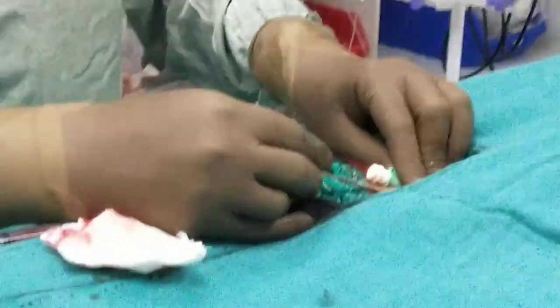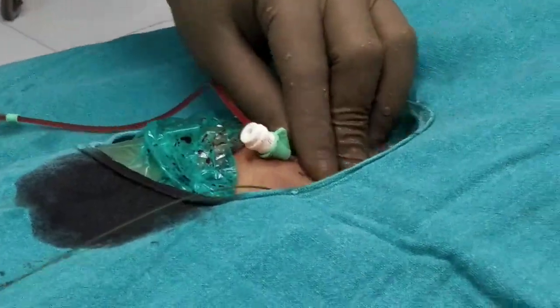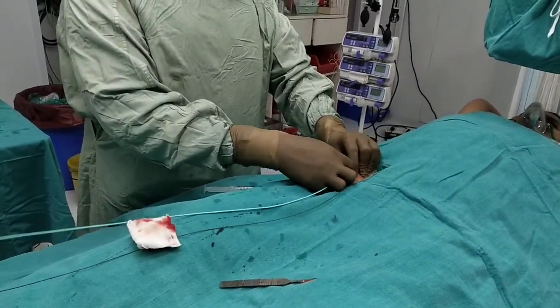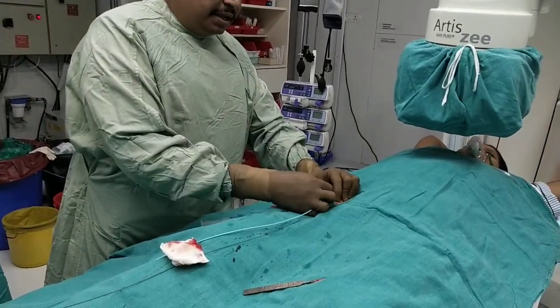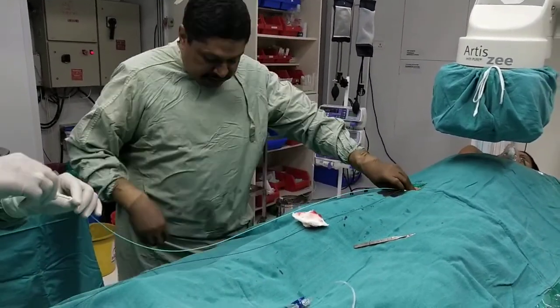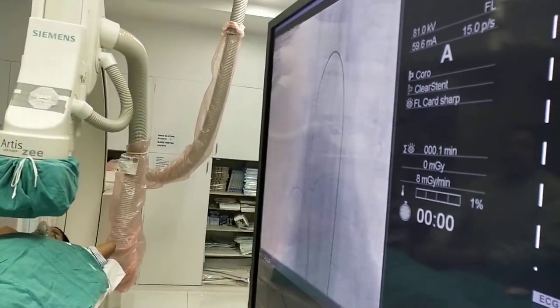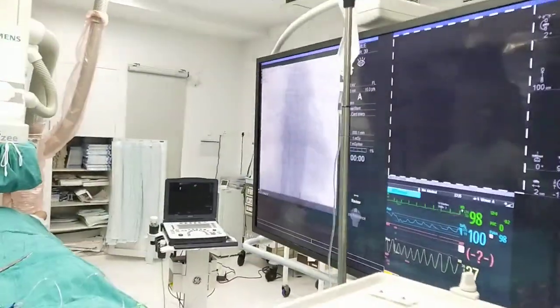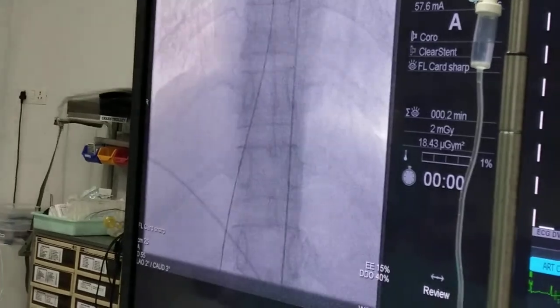We make a liberal cut into the vein because we have to pass a balloon track, so we need a good access area. We will now put a pigtail into the artery up to the aorta, which will act as a central aortic pressure measurement, as well as a marker in the aorta for guidance of transseptal puncture.